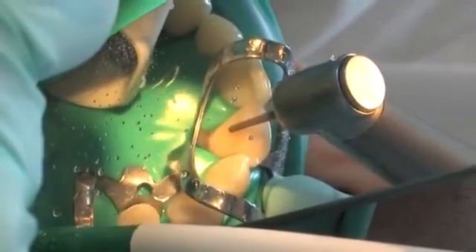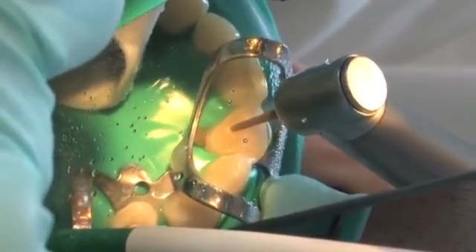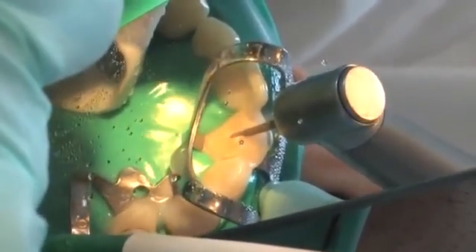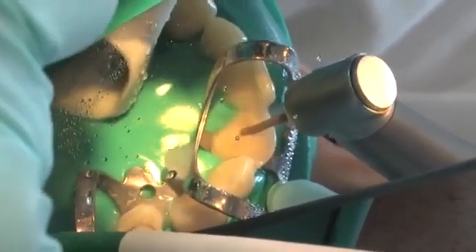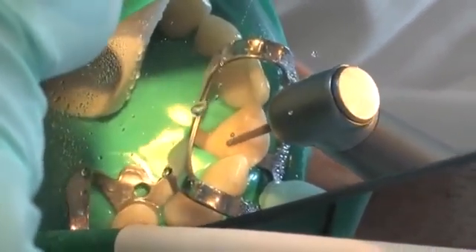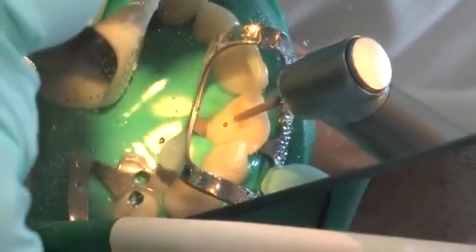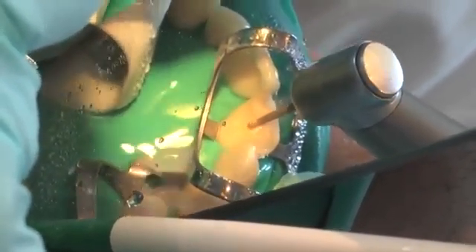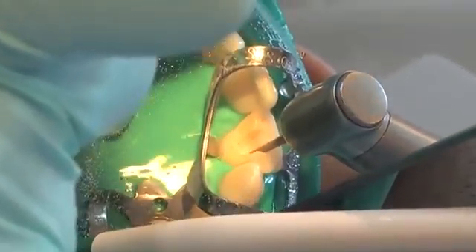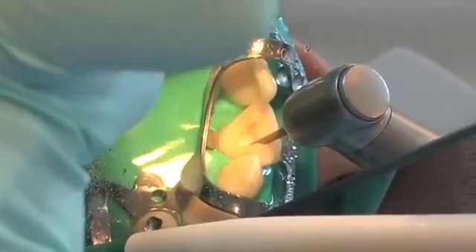The root canal is exposed from the palatal surface until contact is made with the root canal filling material, while removing as little tooth structure as possible. The appropriate diameter and length of the post can be determined using a radiograph. It is important that a sufficient wall thickness of at least 1 mm is preserved to prevent the risk of a perforation or weakening of the root.